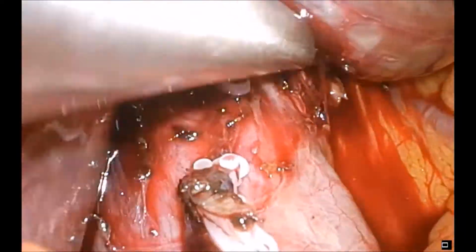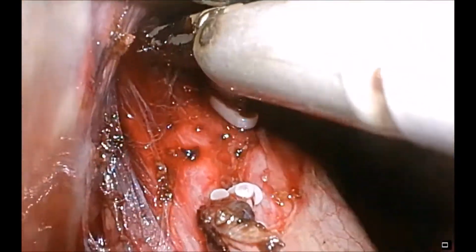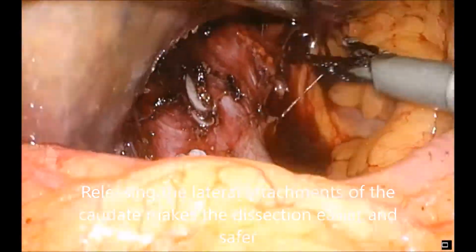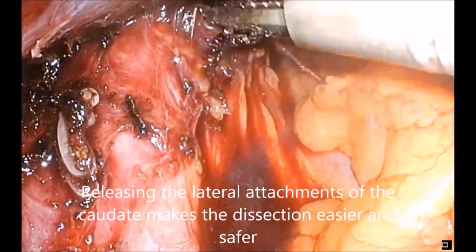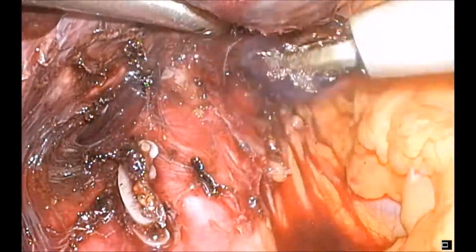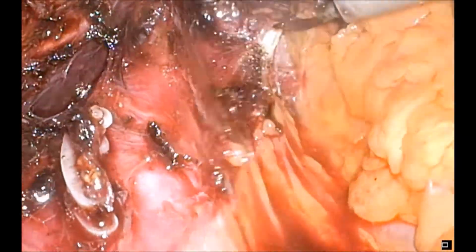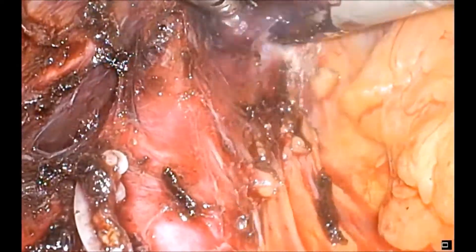The surgery is being performed using an Olympus three-dimensional laparoscope with glasses that give a three-dimensional type view. It's a very comfortable way of observing what's going on, and in some ways may help with the dissection and recognition of structures, and certainly helps with suturing and a feeling of depth perception that can only be gained through 3D imaging.